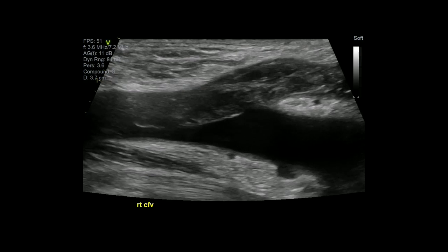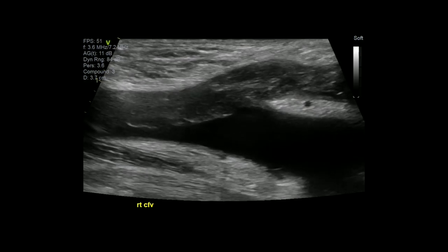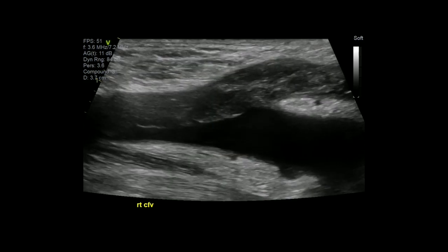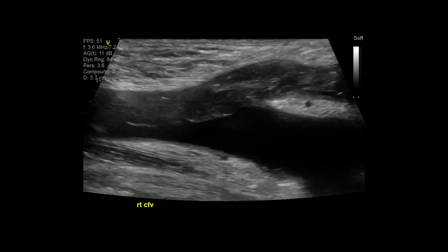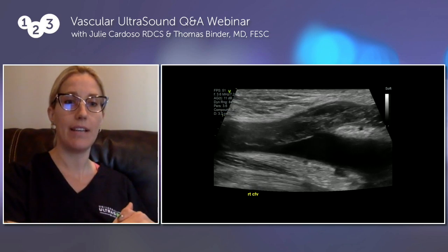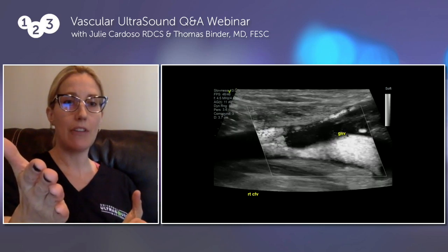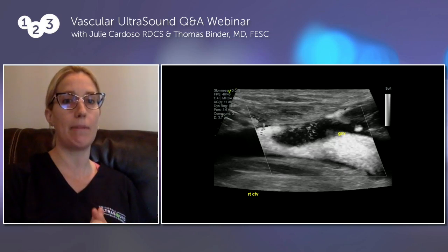Go to the next clip. And as you can see, the free-floating thrombus to the left of your screen is why I say do not do your compression maneuvers first, because if you do, this can potentially dislodge and cause the patient a pulmonary embolism. This is a beautiful picture of the extension going into the deep system from the great saphenous vein. And you can see with B-flow imaging in our next clip how this thrombus is taking up more than 50% of the lumen of the common femoral vein.